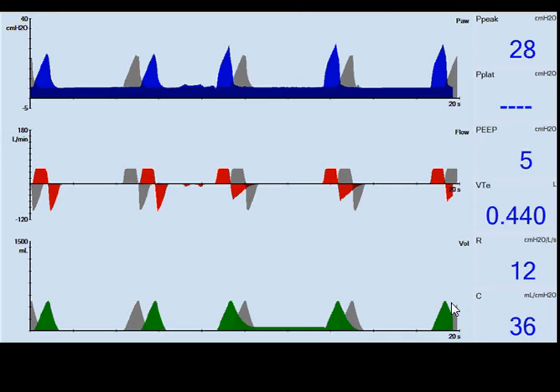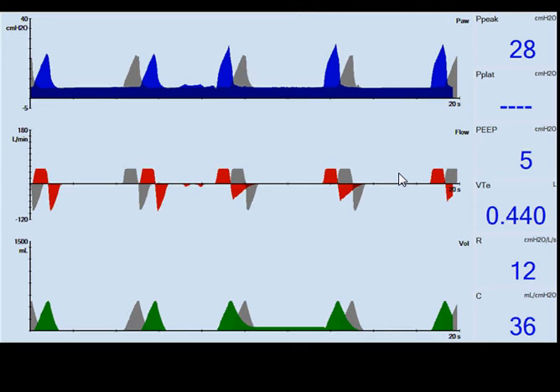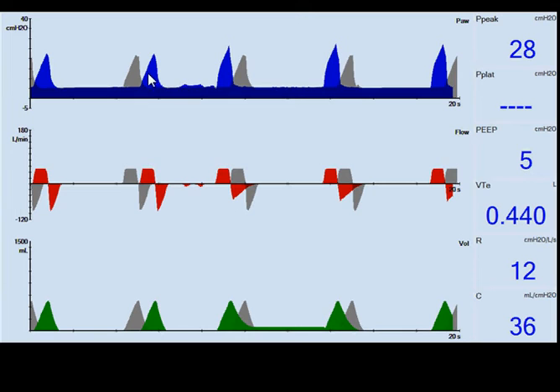We changed the resistance to a higher resistance of 12. The peak inspiratory pressure went up, but the flow waveform remains constant. The ventilator is going to try to deliver the same volume every time. The volume display is an average of breaths, so it will remain the same. Volume is constant and pressure is changing, increasing versus baseline.